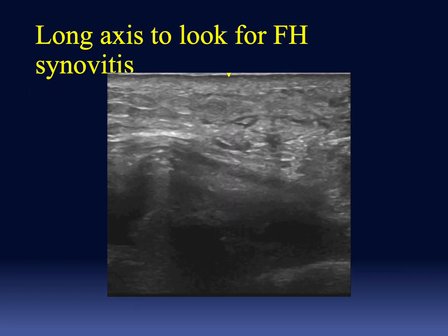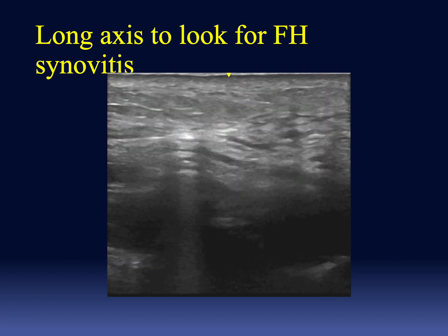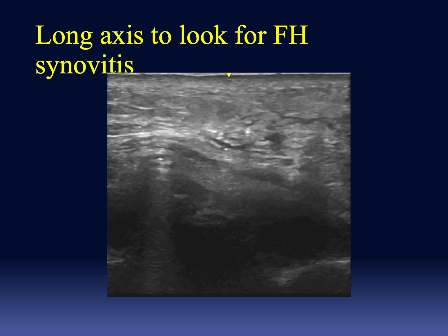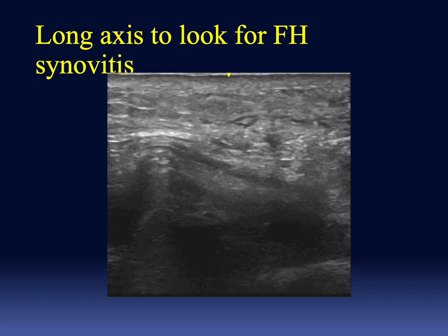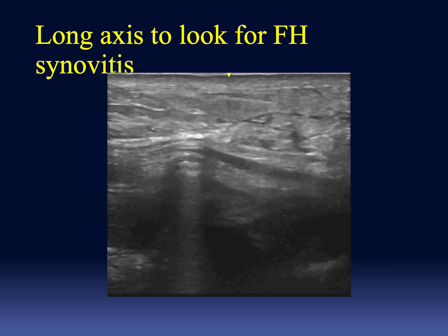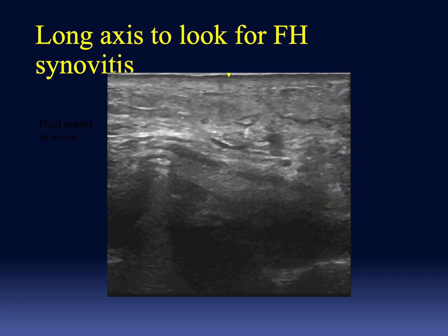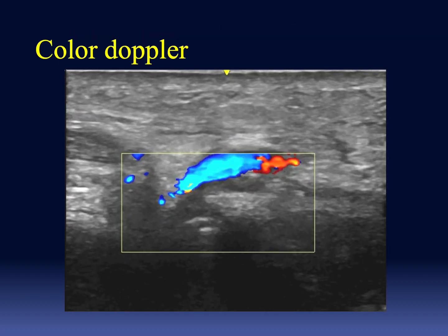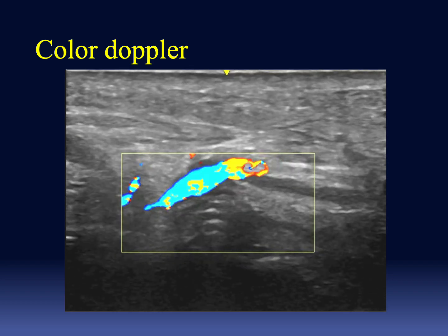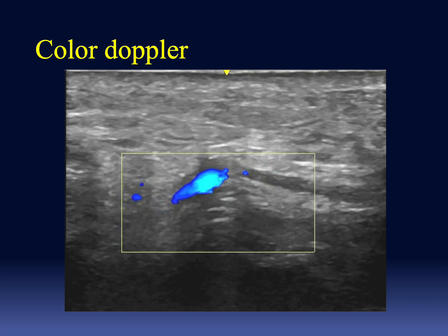On this long axis view, we can see the tip of the screw toward the left of the image, and there is fluid along the tip, which would be consistent with a tenosynovitis, but in this case it seems to be pulsatile. So we proceed with the Doppler, and we can see that the tenosynovitis is actually an artery and two veins at the tip of the screw.